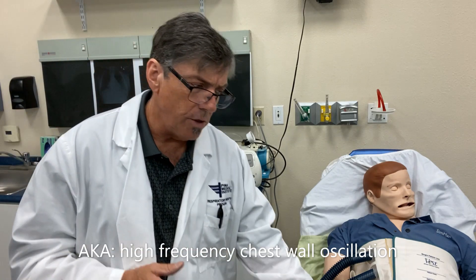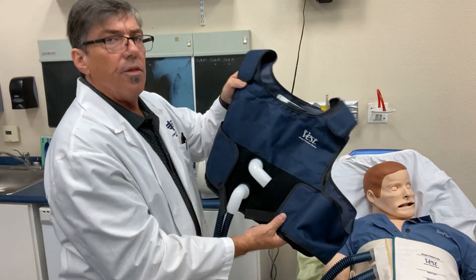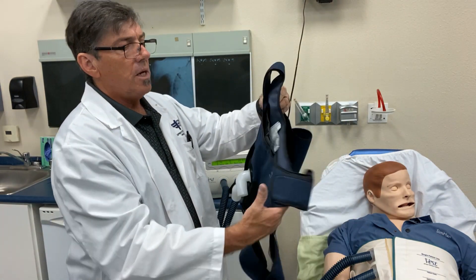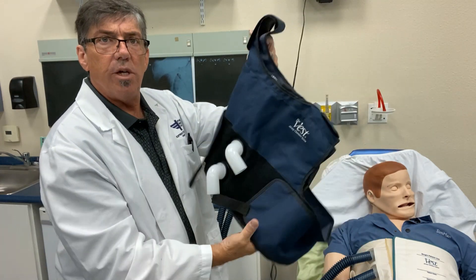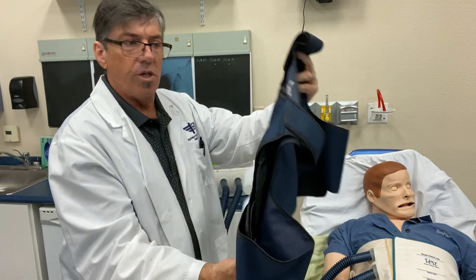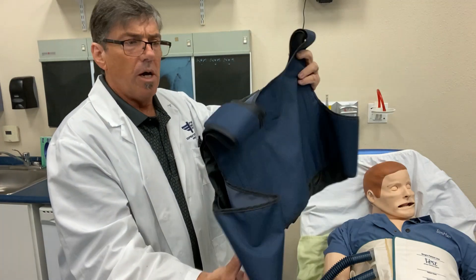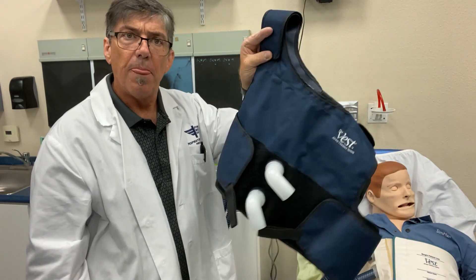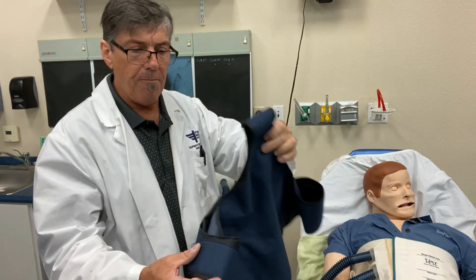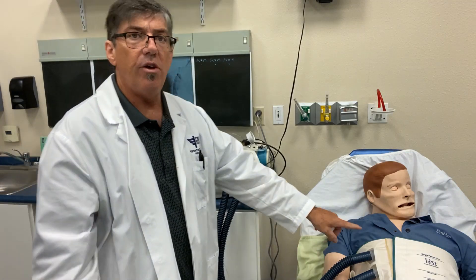Just to note — vest patients for cystic fibrosis will usually use the non-disposable vest. It goes around the shoulders, the two connections are here, and this is non-disposable, so you don't see this used too often in the hospital. Cystic fibrosis patients will bring their own vests in with them. But for hospital use, we do have disposable vests, and that's what we have here on our SimMan.